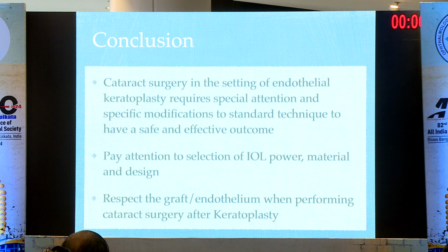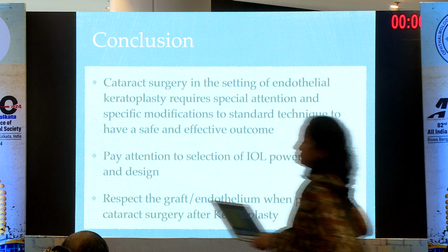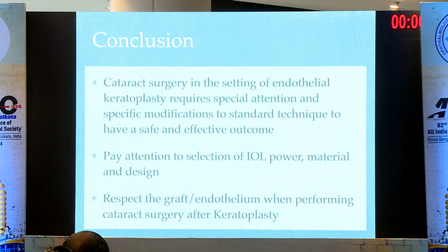So cataract surgery in the setting of endothelial keratoplasty requires special attention and specific modifications to standard technique to have a safe and effective outcome. Pay attention to selection of lens power, material and design. Respect the graft and endothelium while performing cataract surgery after any keratoplasty.